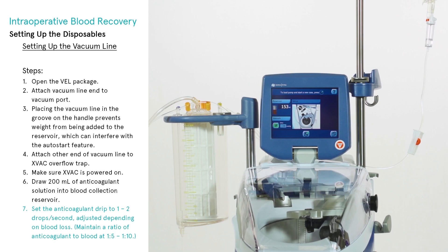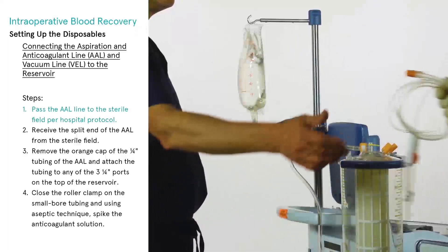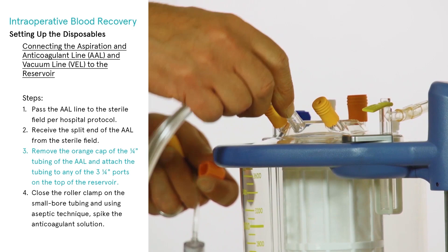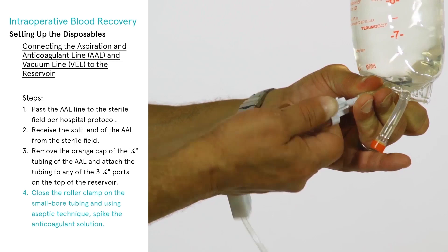The anticoagulant drip rate should be adjusted depending on blood loss during the procedure — maintain a 1:5 to 1:10 ratio of anticoagulant to blood. To connect the aspiration and anticoagulant line (AAL) to the reservoir, pass the AAL line to the sterile field per hospital protocol, then receive the split end of the AAL from the sterile field. Remove the orange cap of the ¼-inch tubing and attach it to any of the three ¼-inch ports on the top of the reservoir. Close the roller clamp on the small bore tubing and, using aseptic technique, spike the anticoagulant solution.